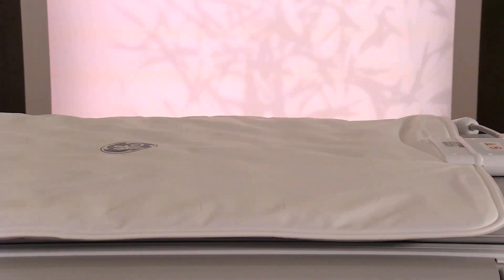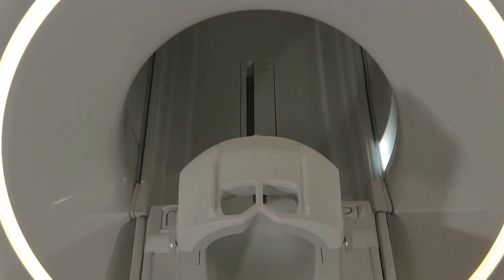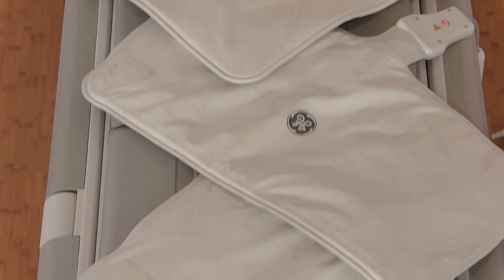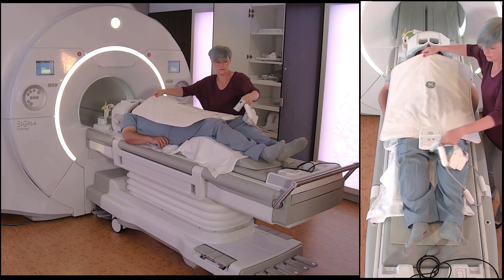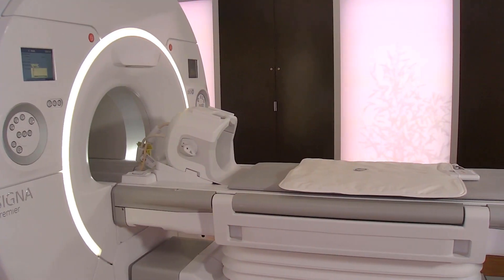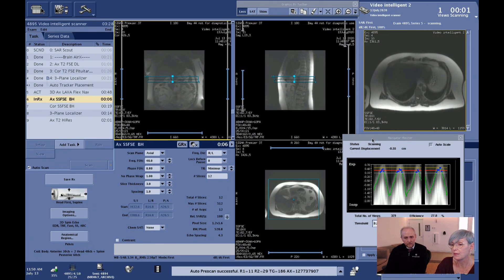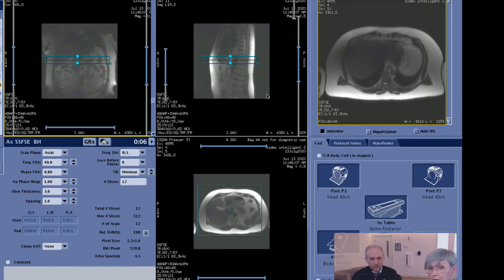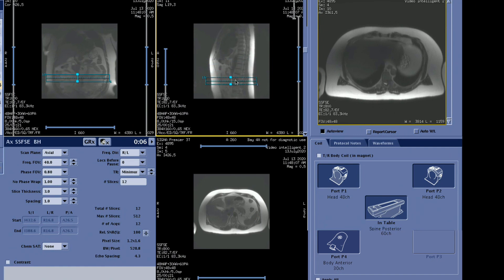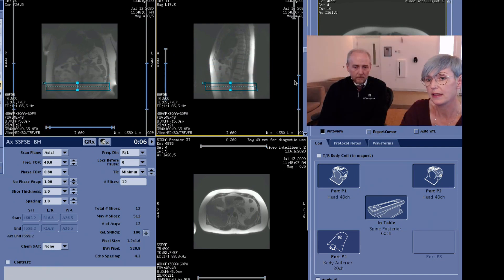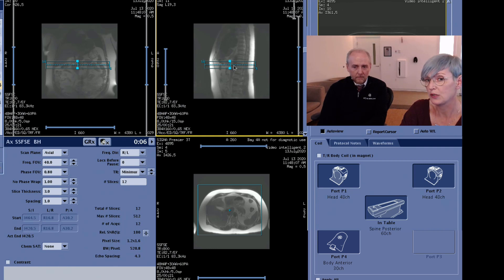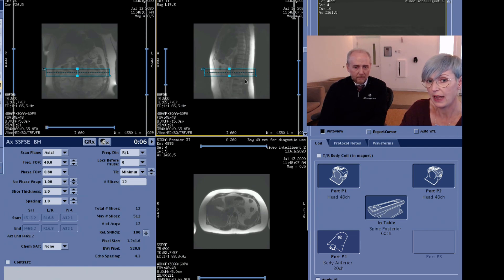So let's head over to the scanner and show you what it's all about. The Air workflow means we are using AirTouch for coil setup. I will close the navigator window here since we have finished it, and you can see now that I prescribe just a tiny SI coverage. I can move through the entire abdomen and you can see the blue lines are just following my field of view. That is what AirTouch does — it understands exactly how much coverage we need for that field of view and customizes the coil setup for that sequence.